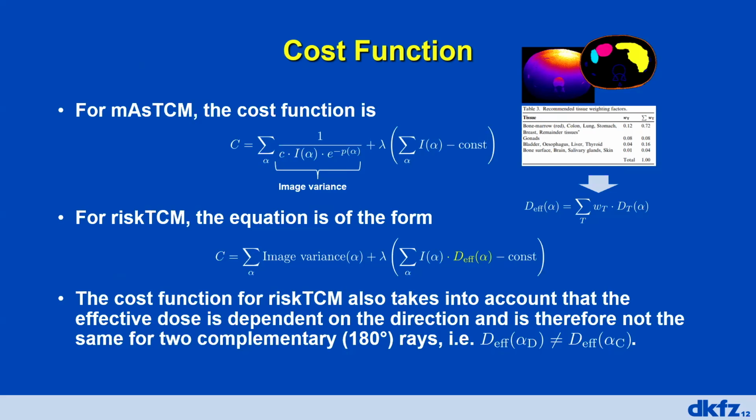As far as I understood your question, I think it's the other way around. We already need those organ weighting factors. Of course, we can predict which organ receives what level of radiation dose. However, this does not tell us anything about the radiation sensitivity of said organ, right? So we also rely on ICRP values, as shown on this slide. This table is somewhat copied from the ICRP, I guess. So we also require these factors.